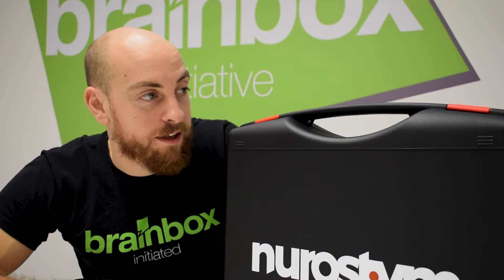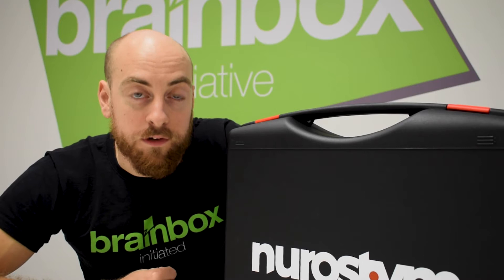Hello and welcome to this nurostym unboxing video. We'll be taking a look inside this black case and seeing what a nurostym user will receive upon delivery of their nurostym device.